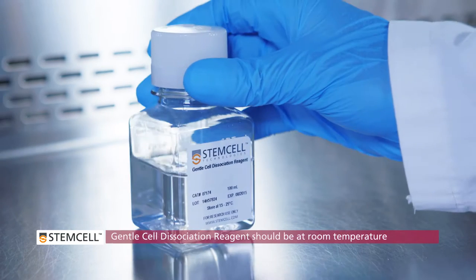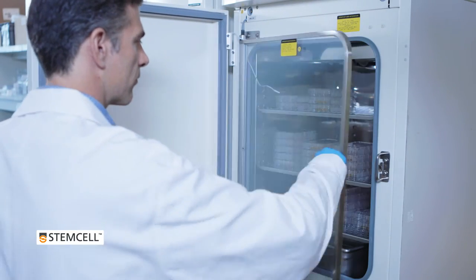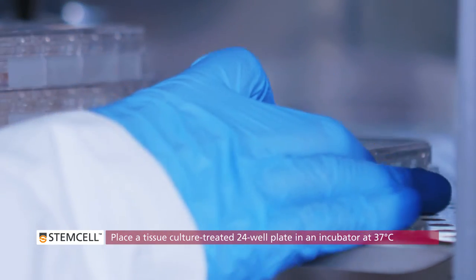Place gentle cell dissociation reagent on the bench top, as it should be at room temperature for this procedure. Place a tissue culture-treated 24-well plate in an incubator at 37 degrees Celsius.